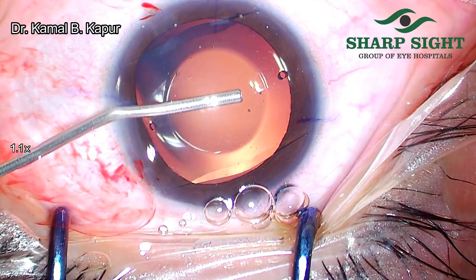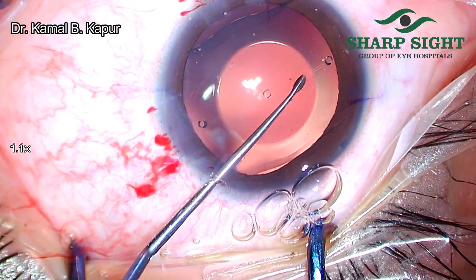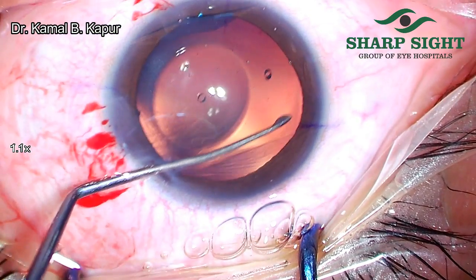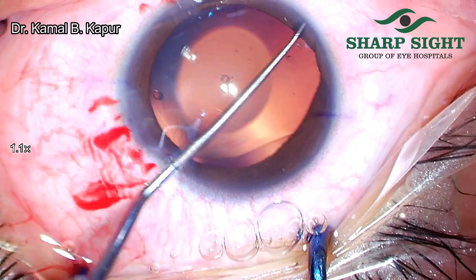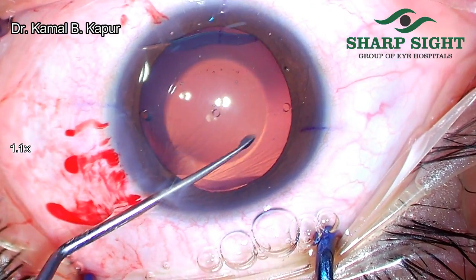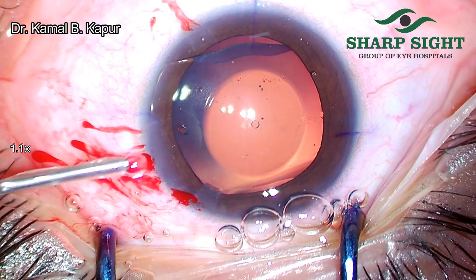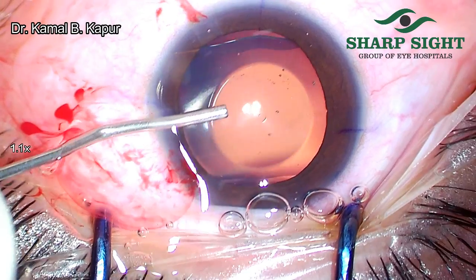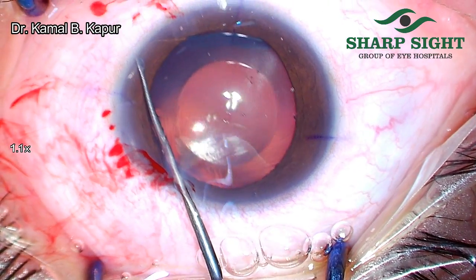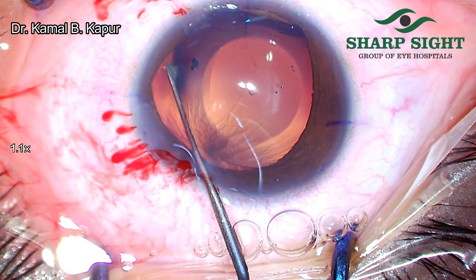Once having done that, you can proceed with the normal way of placing the ICL back in the eye, pushing some viscoelastic on top of the ICL and making sure it's slightly backwards. The same maneuver is repeated for the other two haptics, making sure that very slow pressure is applied. Viscoelastic is again instilled over the ICL, and the tucking of the loop behind the iris and a similar move is repeated on the other side.